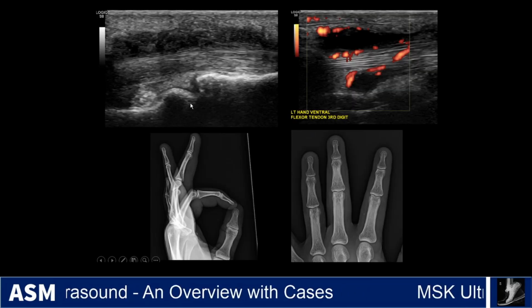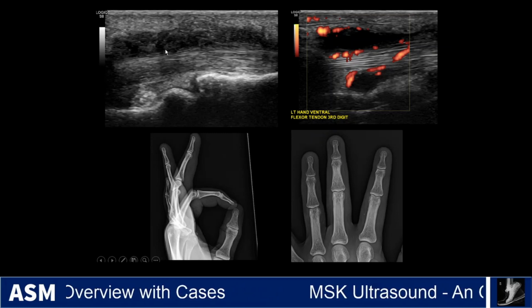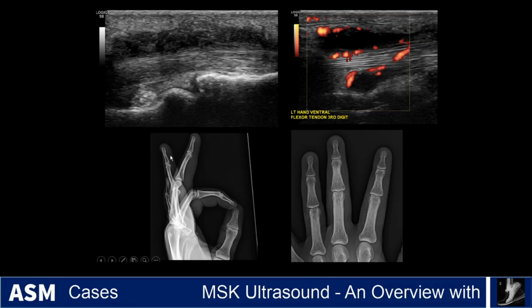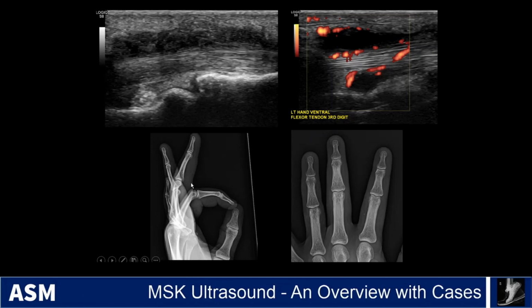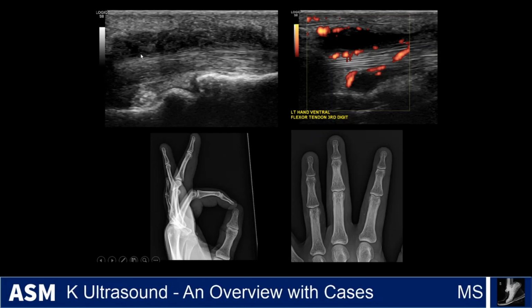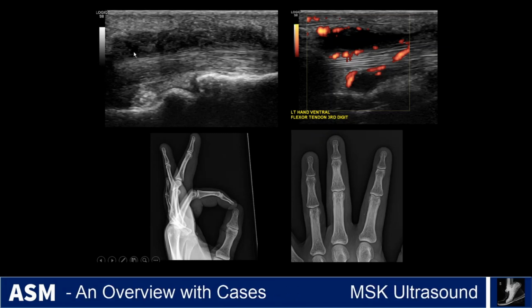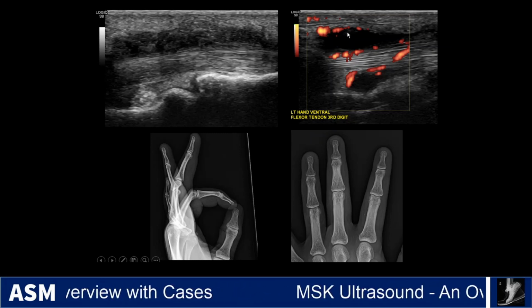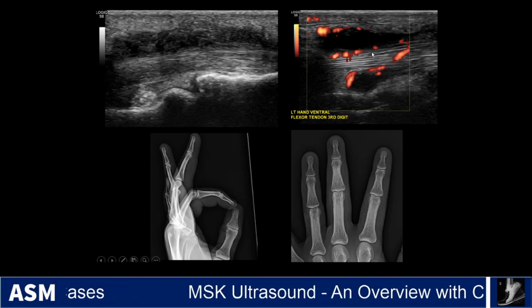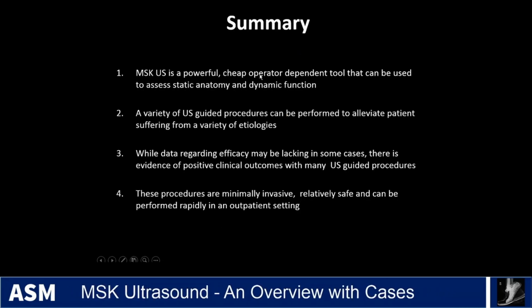This is a patient who presented with history of psoriasis and sausage digit on exam per the rheumatologist, and the third and second digits were swollen, and you can see the normal fourth digit here. And if you look carefully at the second and the third digits, you see that there's increased soft tissue on the volar side, and in the same area on ultrasound you see this synovial proliferation, this hypoechoic material with some fluid in it, and especially even more proximally we saw a lot of fluid, a lot of hyperemia. So in this case the sausage digits were at least in part due to severe flexor tenosynovitis, which may be seen in psoriasis.